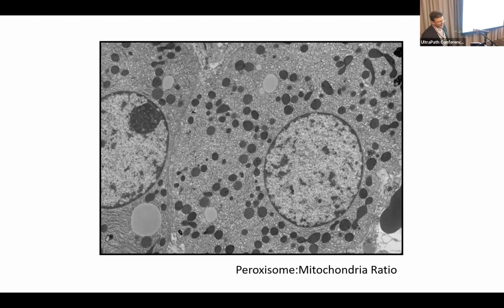But it's worth noting that if you're searching for peroxisomes, they're not evenly distributed throughout the hepatic lobule. Near the portal areas, you might find only about 1 peroxisome to 5 to 10 mitochondria in those hepatocytes. And then, back to what we mentioned earlier, how the function of hepatocytes changes as you move from zone 1 towards zone 3.